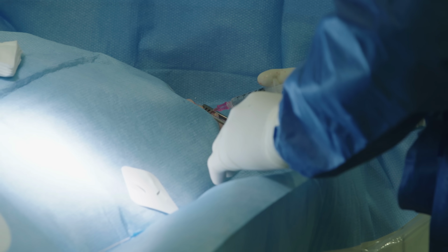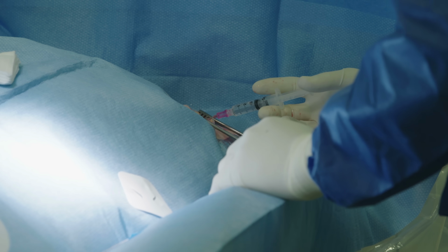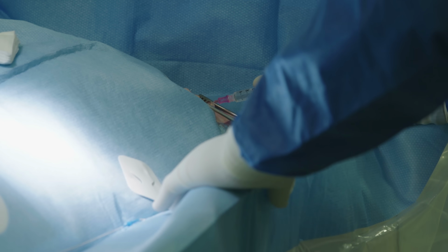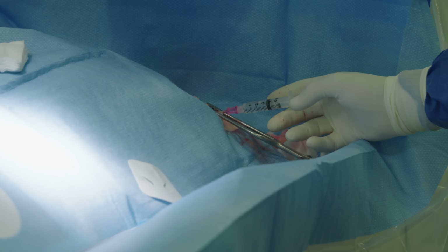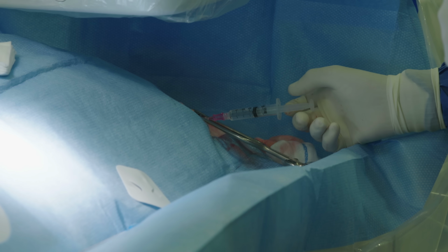And so we fish a small catheter up into the top of the heart, and we squirt some dye down the 3 arteries of the heart, and all of its side branches, of course. And then that gives us a roadmap right away. The minute you do that first shot, you know exactly what's going on. Okay. So these are all tests that are basically trying to determine if there is some coronary artery disease, to see if the muscle of the heart isn't getting enough blood flow and therefore not working right.